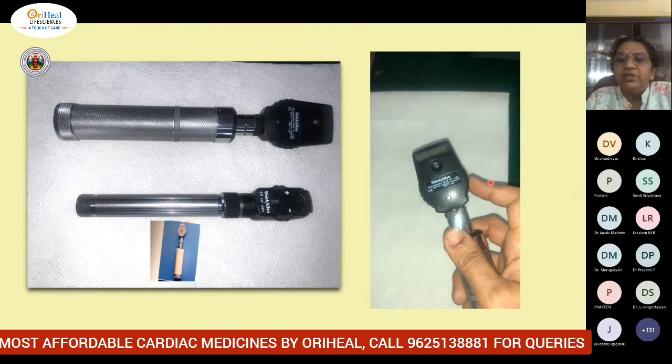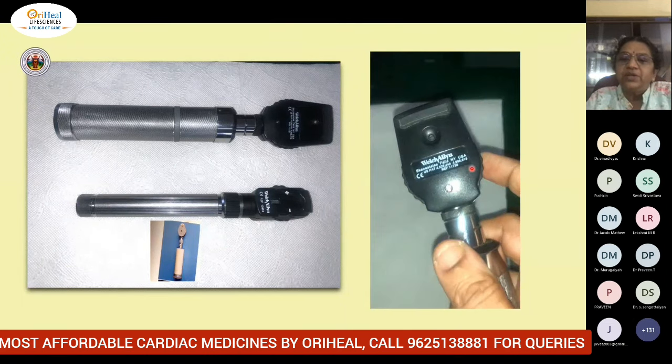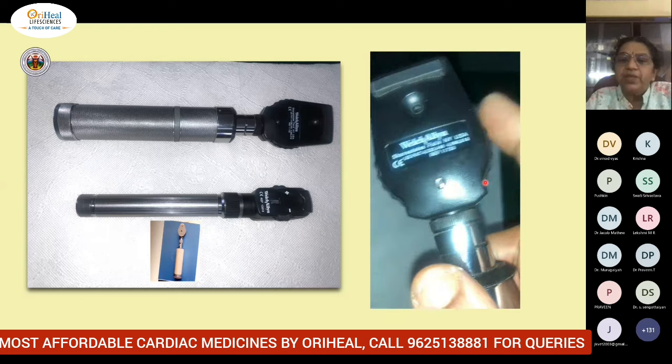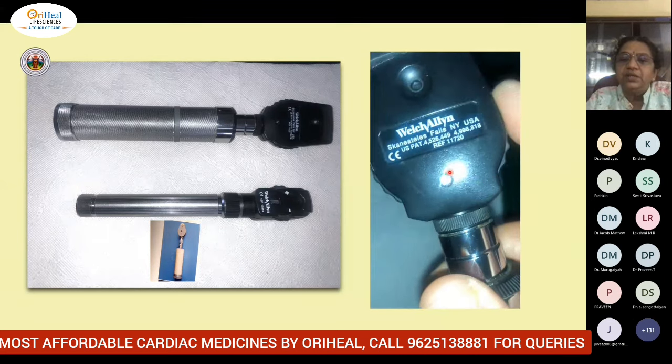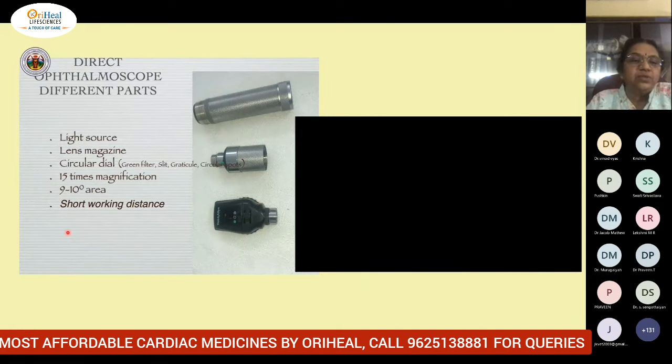Then on one side, you will find another circular dial. This is called a lens magazine. As you turn the lens magazine, the lens diopter power will appear here. Green numbers indicate a positive lens, and red numbers indicate a negative lens. The magnification is 15 times, but the disadvantage of the direct ophthalmoscope is the very short working distance.